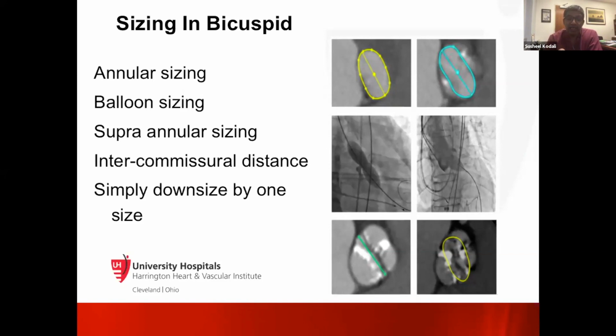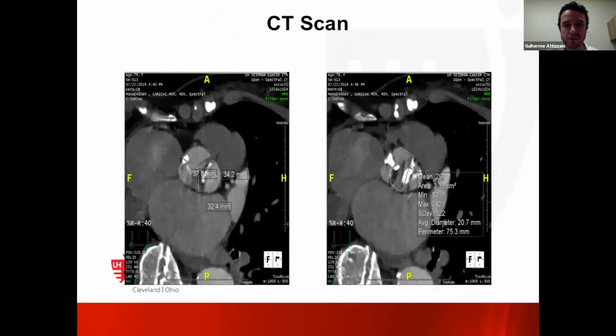And this heavily calcified, if you go back just maybe 2 slides. No problem. I can go back to show here. Yeah. You see that really calcified raphe. If you're doing a balloon expandable, in many of these cases, that raphe is not going to allow the valve to sit in that direction, and everything's going to be canted in the opposite direction. In this case, towards the left main, it looks like.